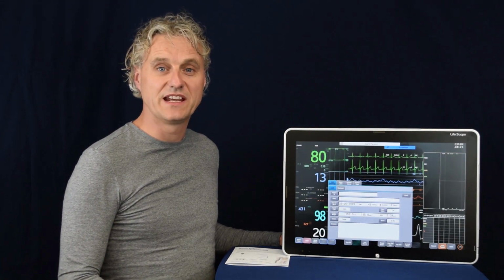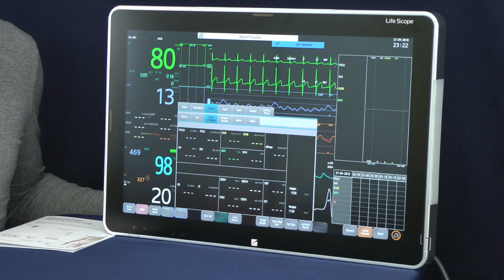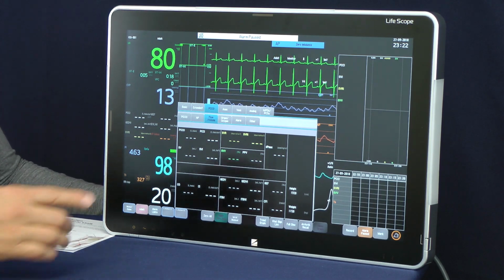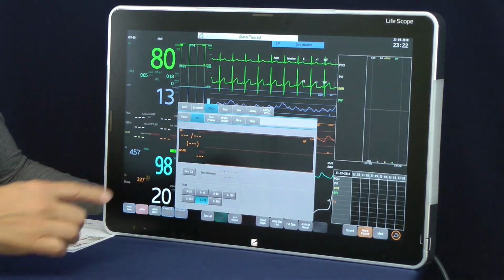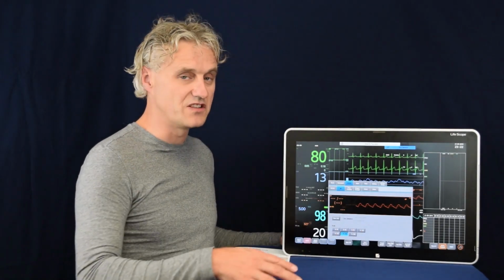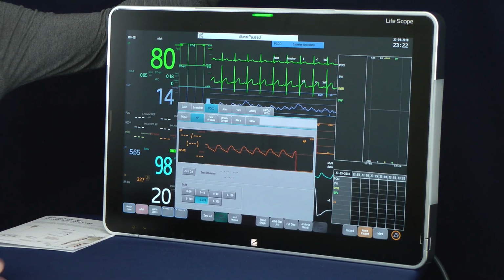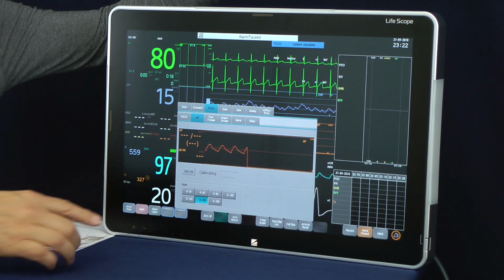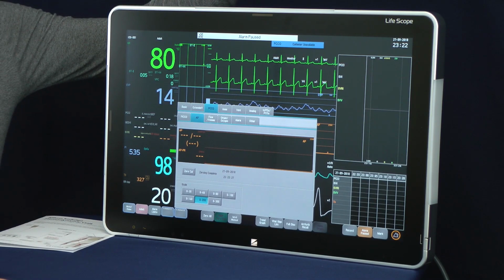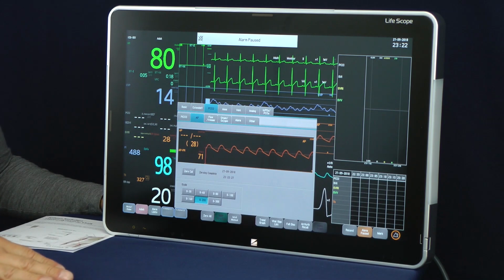The following steps need to be taken to perform a PiCCO measurement. We will go to the left part of the screen, which brings you to the tabs. Now go to the arterial pressure tab, the second one, by simply pressing it. As you can see, we still don't have any numbers. The curve is visible. We need to zero this. By simply opening the stopcock to the open air, you can press zero and a zeroing will be performed. Closing the stopcock again, the arterial waveform curve will come back and the numbers will be displayed.